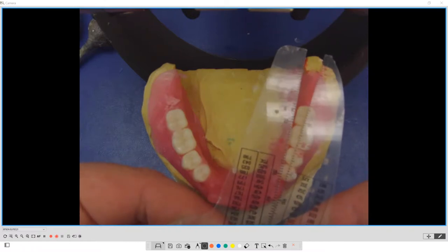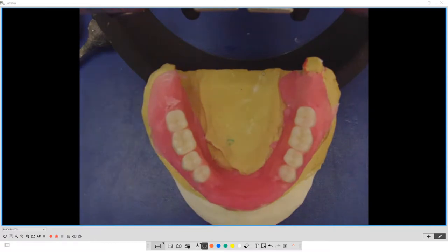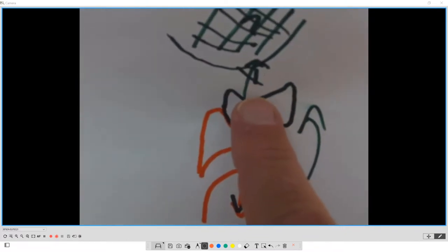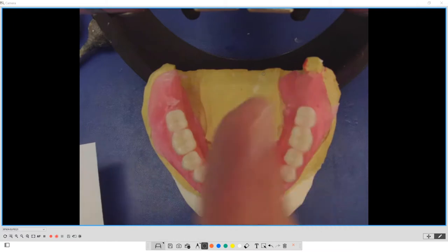So I'm moving my rulers to facilitate that. So I don't have to set over the ridge. I'm setting it within that triangle and that zone limit. That's setting it for the person based on anatomical structure. So again, it's a departure from what we're used to, but I'm not letting the lower, excuse me, it's upside down. I'm not letting the lower dictate what's going on where the upper is. I'm going to blend everything in. So I'm having freedom here of where I can set teeth.